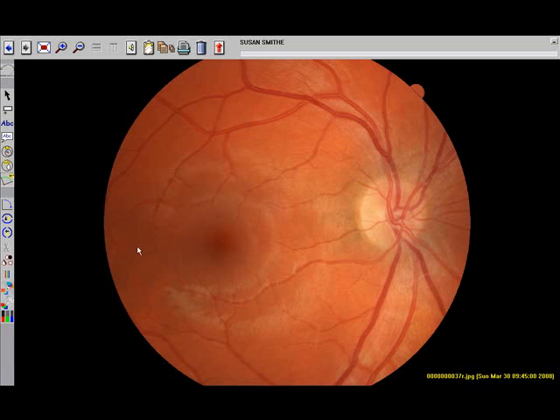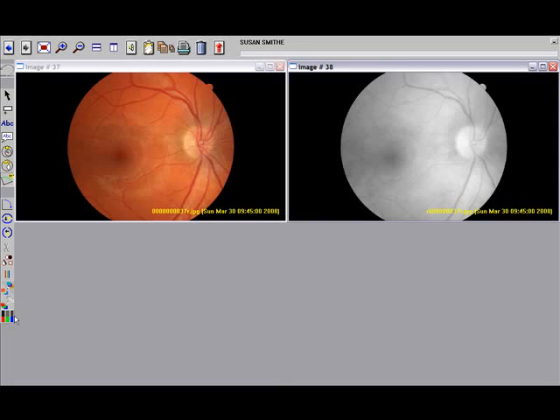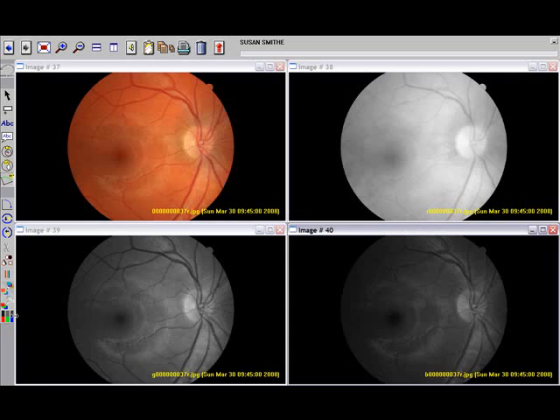If you wish to break the image into its three-way RGB components, press the RGB Separation button. This is very useful in determining which pathology resides in which layer of the retina.